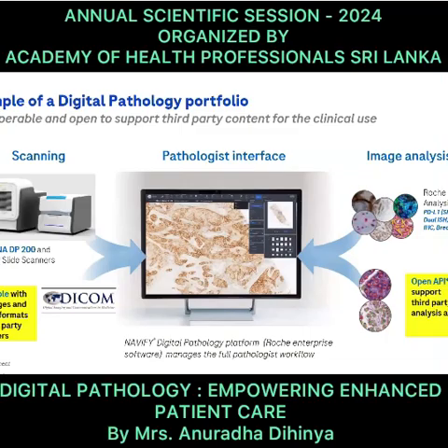Now, in the market, when you're planning to go ahead with the scanners and the algorithm piece from one particular company, they might be limited to a few of these algorithms, maybe limited to the breast profile markers or the lungs. But nowadays there are many algorithm companies available in the market. You need to see that whichever scanner or software you're planning to buy, those third party algorithms can be integrated with it seamlessly.